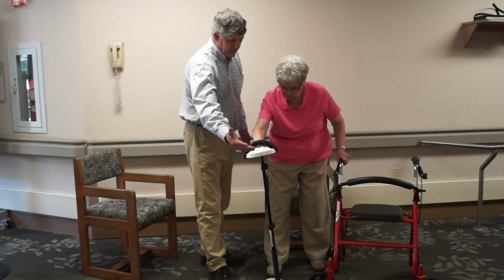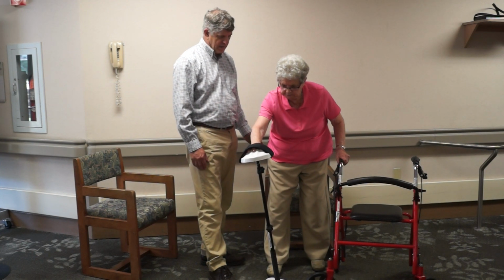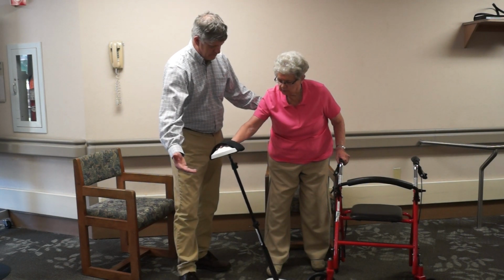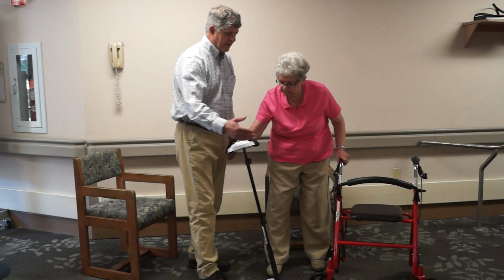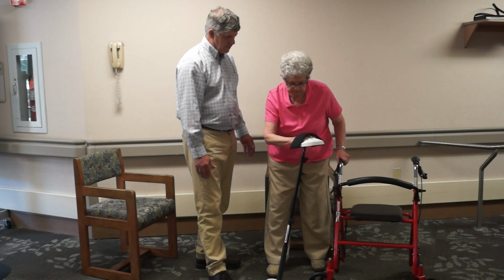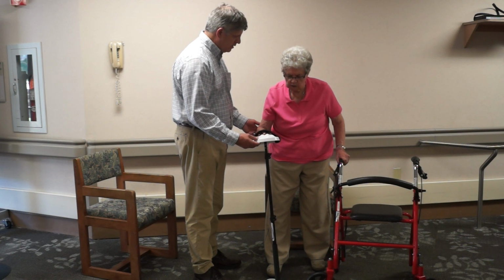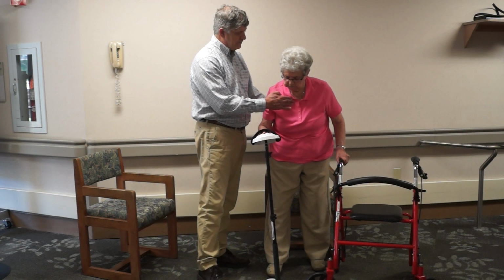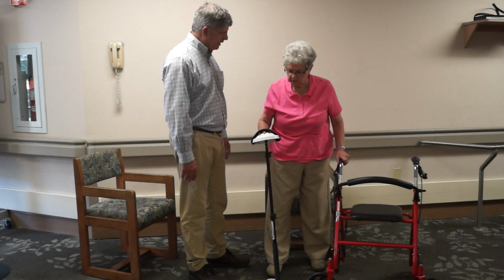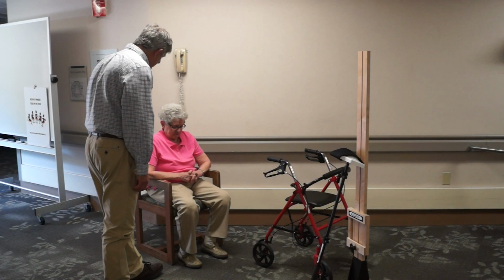And then remember to reach out or to look out. Look out where you're reaching to. Okay? Go ahead and come back. And then can you reach over this direction? Sure. And then how about over this way? You betcha. Very good. Okay, nice work. Now just do a couple short ones again. Okay, stand tall. That'll just support your hip muscles and your breathing again. So everything's coming together.